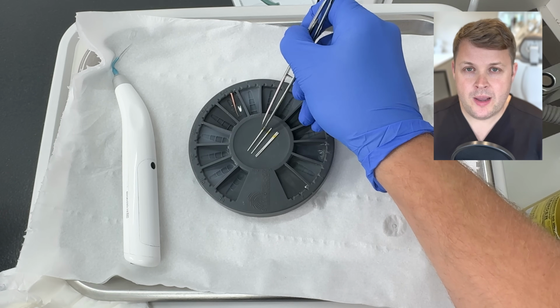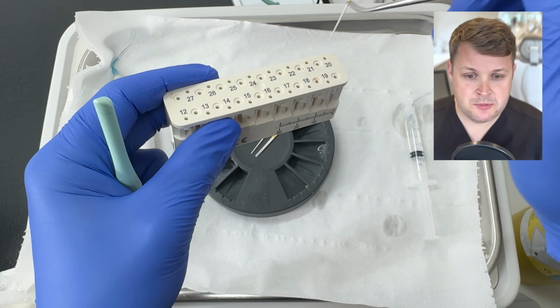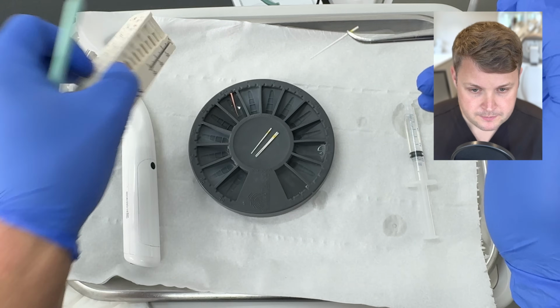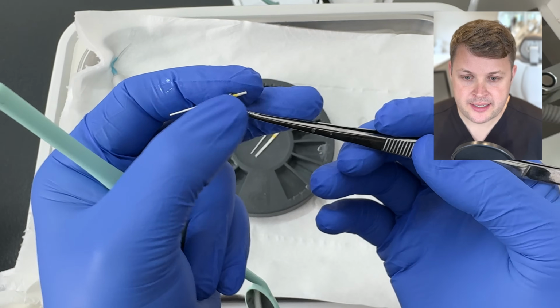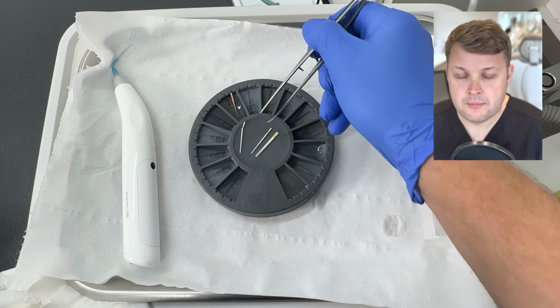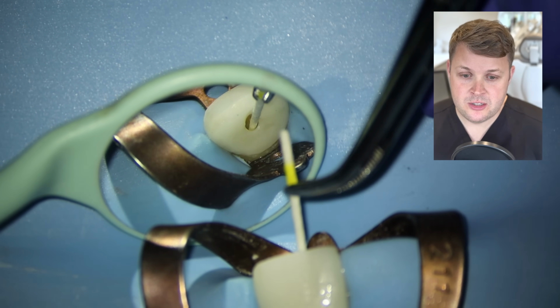And then, because it's quite wide, what I don't want to do is push these paper points through this wide open apex, despite the fact that these paper cones, as I say, they're 50 and the apex is 50. So I'm going to measure a paper point and use that as a guide, so I know at which point I need to be gripping the other ones, because I don't want to push the paper cones into the measuring block because it's not sterile.